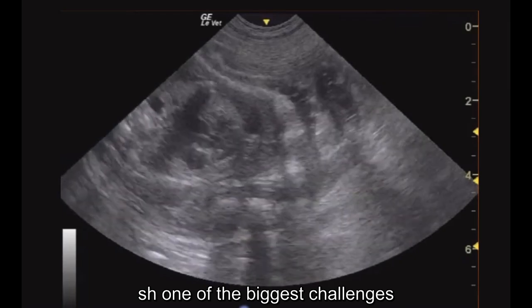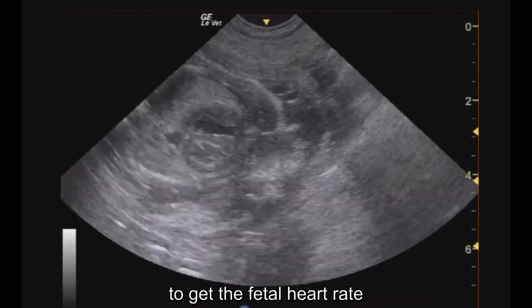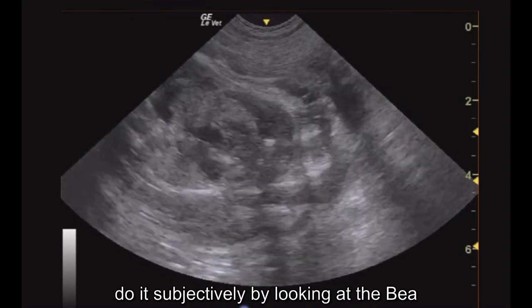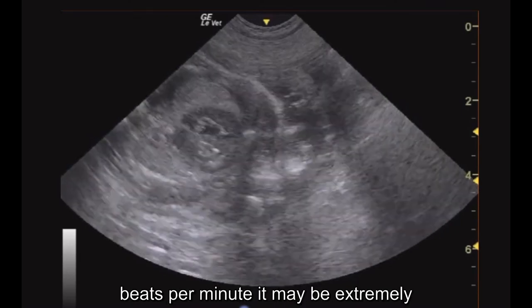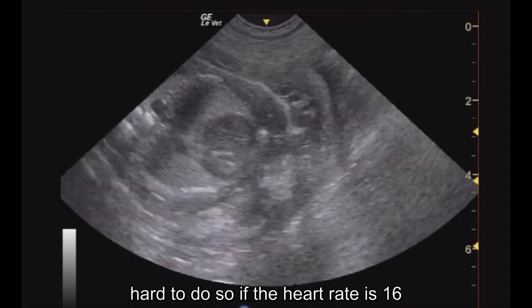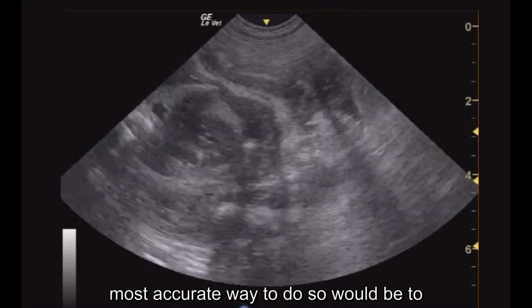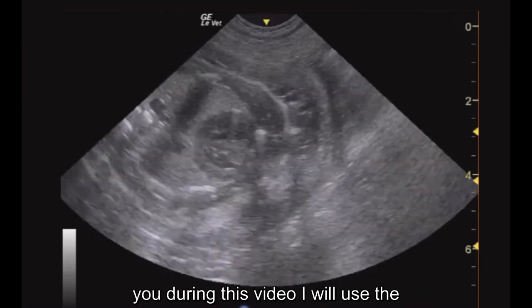One of the biggest challenges veterinarians may deal with while trying to get the fetal heart rate is the accuracy. Because if you just try to do it subjectively by looking at the beating heart of the fetus and counting heartbeats per minute, it may be extremely hard to do so if the heart rate is 160, 180, or greater than that. Therefore, the most accurate way to do so would be to use the M mode, which I'm going to teach you during this video.